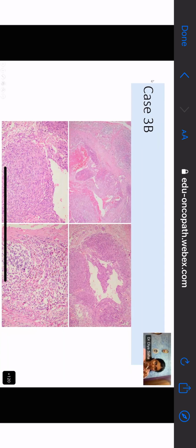You don't think that these spaces are part of this tumor, or they're just there by the way? It is such a characteristic part of this tumor, right? And they're not lined by endothelial cells. So it's a bit odd for it to be a blood vessel tumor. But anyway, you said blood vessel tumor. Right, very good.